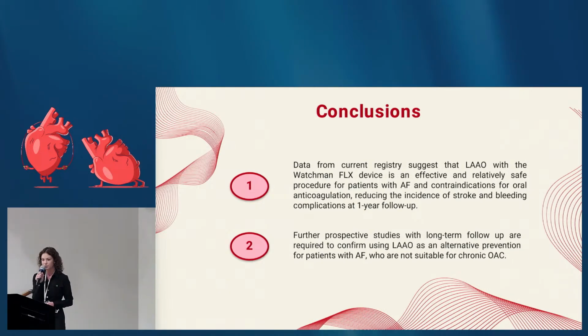However, further prospective studies with long-term follow-up are required to confirm this method as a safe alternative option for patients with atrial fibrillation and high thromboembolic risk who are not suitable for chronic oral anticoagulation.